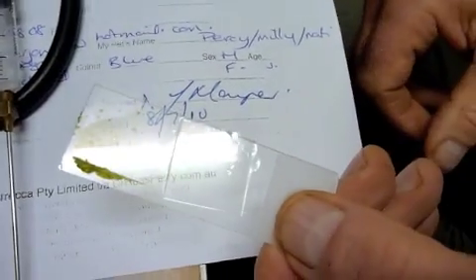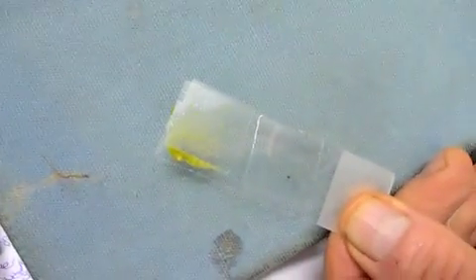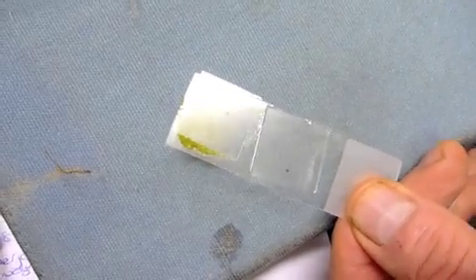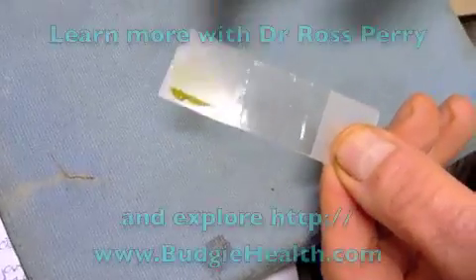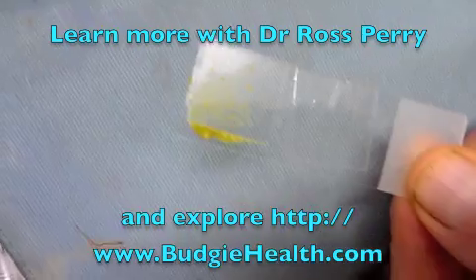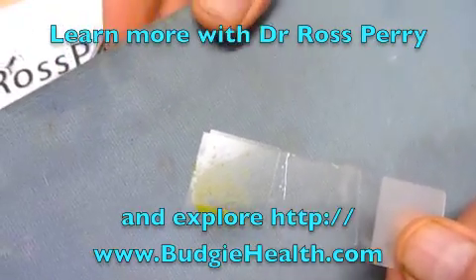The slides are now ready for microscopic examination as wet smears — that will be the next step. There's a faecal smear at this end of the slide, the crop smear at this end of the slide, and I will look at that under the microscope while it's still wet before I do any stained smears.